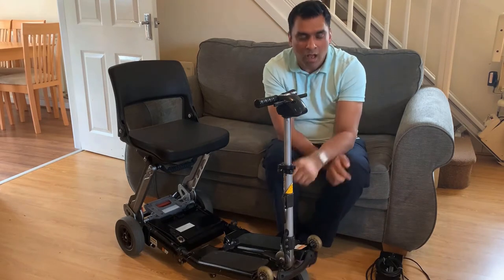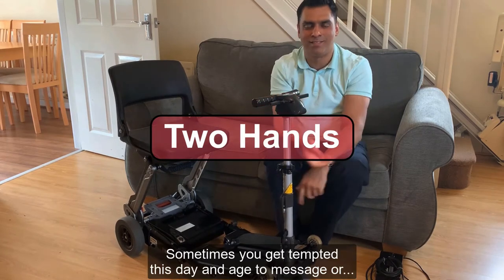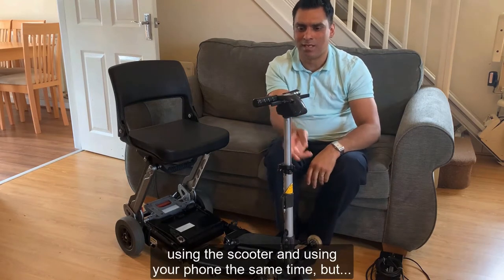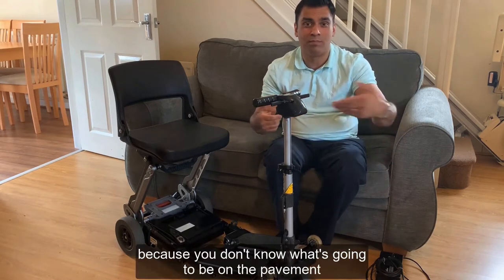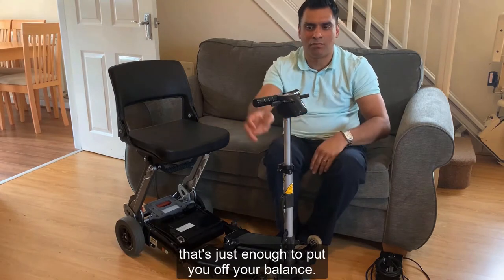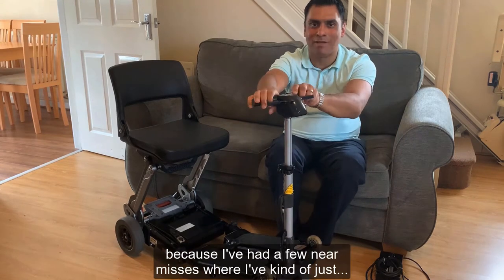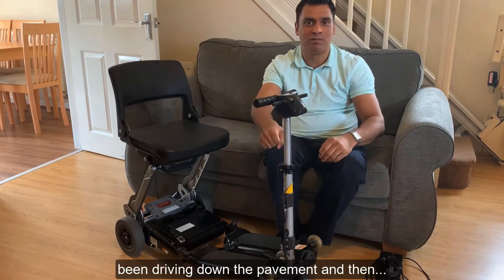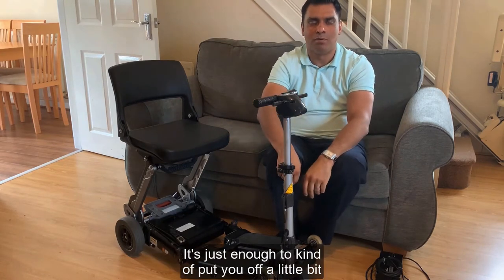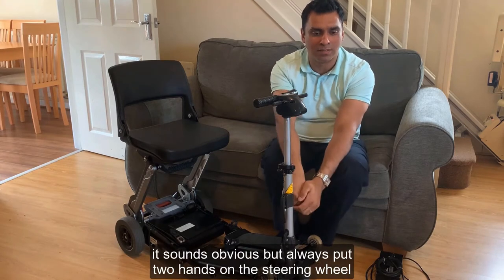This sounds obvious, but always use two hands on the steering wheel. You get tempted to use your phone, but always keep both hands on because you don't know what's going to be on the pavement. Even in Tesco there could be a grape or a Tic Tac - just enough to put you off balance if you're only using one hand. I've had a few near misses where the pavement was slightly uneven, just enough to catch you out.